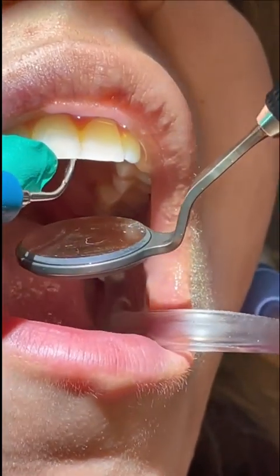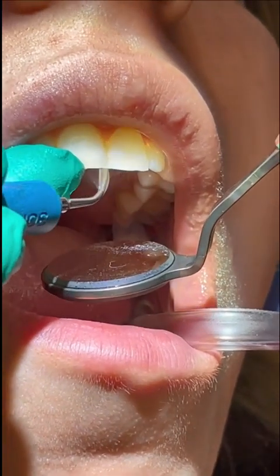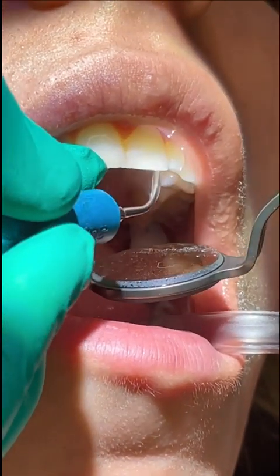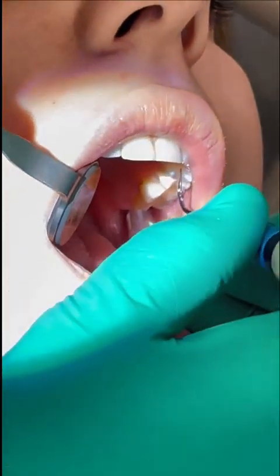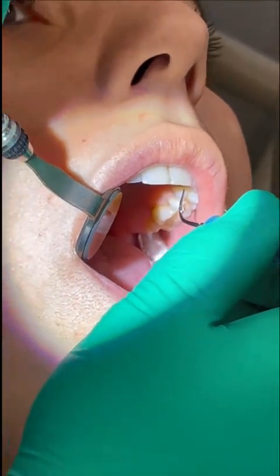At the midline, I switch to indirect vision. I'm still at 12 o'clock for all the anterior teeth, but as I get to the premolars, I move my chair back to nine o'clock, and using my mirror to retract a little bit, I'm able to see the surfaces towards me with direct vision.